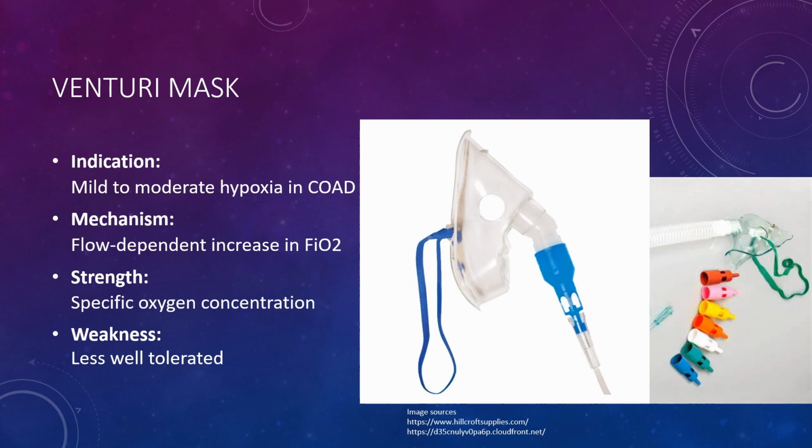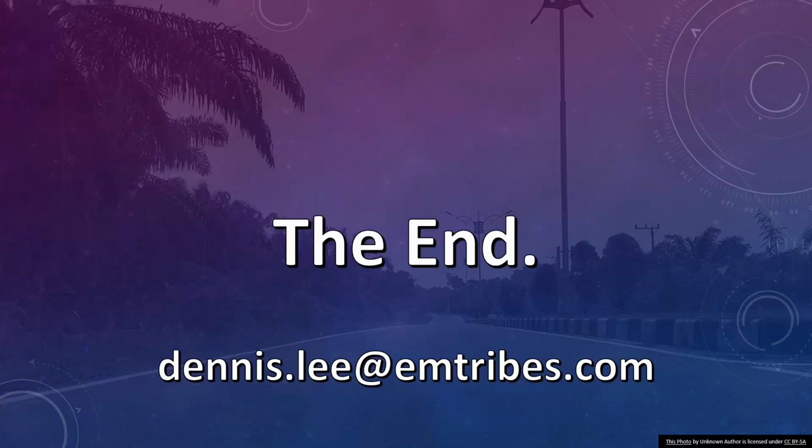But like other masks, this device also has the drawback of patients feeling claustrophobic when it's being used, but it has the advantage over all the others of a guaranteed FiO2 level when used correctly, most suited in the situation of COAD patients. And this brings us to the end of this session.